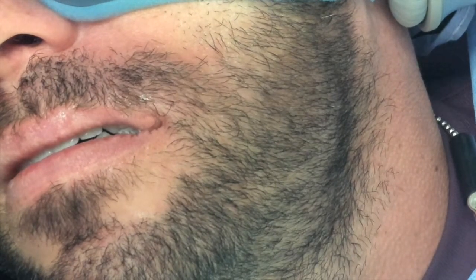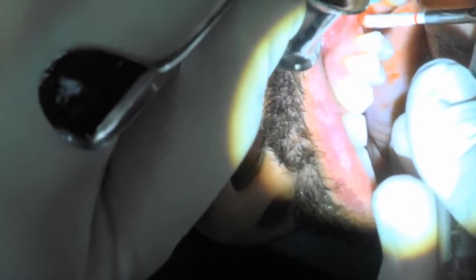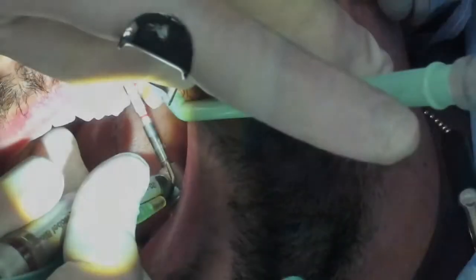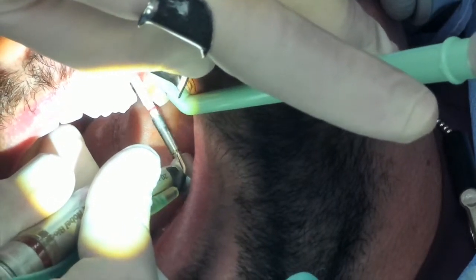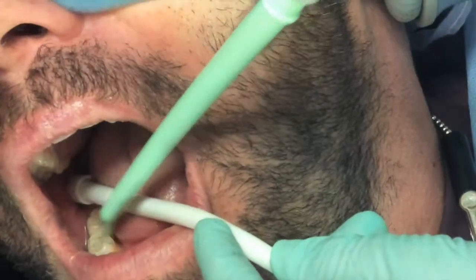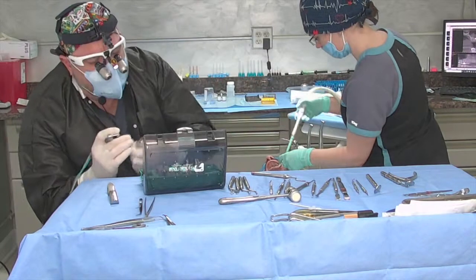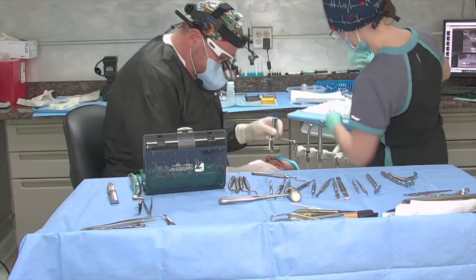So I'm going in with my now 3.25 drill. And remember, this is the 5.0 implant we're going to go in with. So I'm in again. Now I'm going right to 8. And I still got resistance. Sorry about the salt water. The same thing, we got resistance still. So I'm going to turn this upside down so I remember again that we used that one. We're going to go back in with the mirror now.